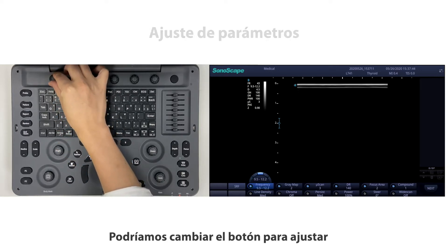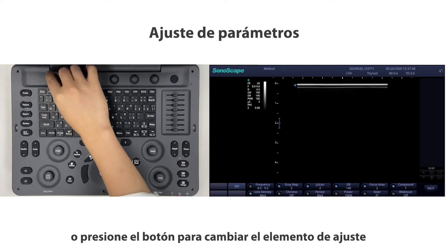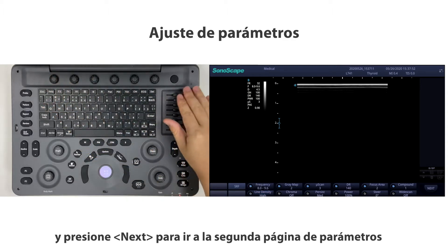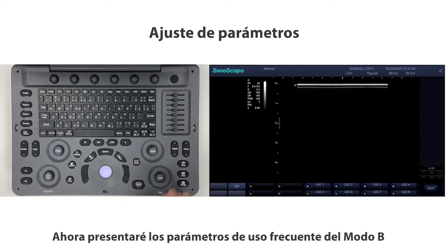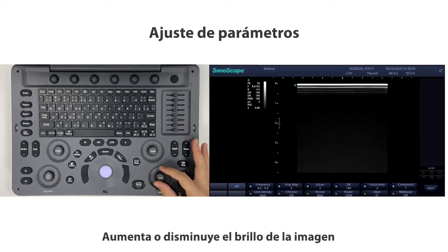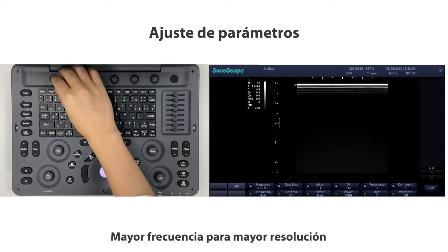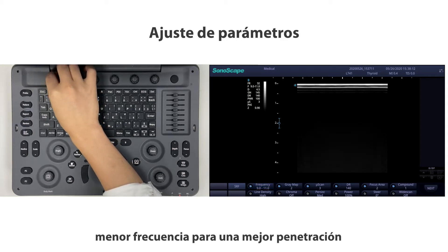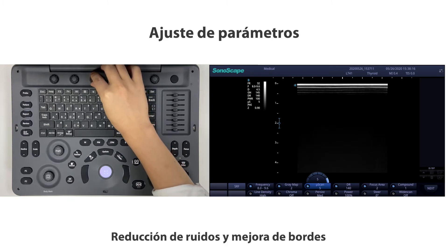You can switch the button to adjust parameters, or press the button to change the adjustment item, and press Next to go to the second page of parameters. Frequently used B-Mode parameters include gain, which increases or decreases brightness; frequency, where higher frequency gives higher resolution and lower frequency gives better penetration; and Muse Scan for speckle reduction and edge enhancement.